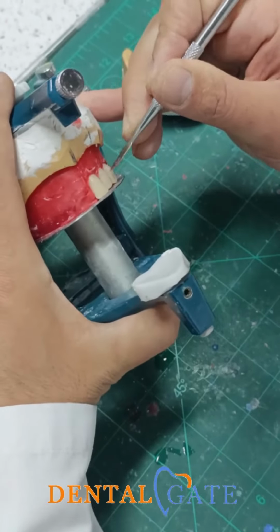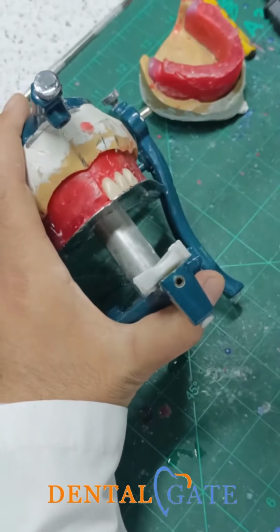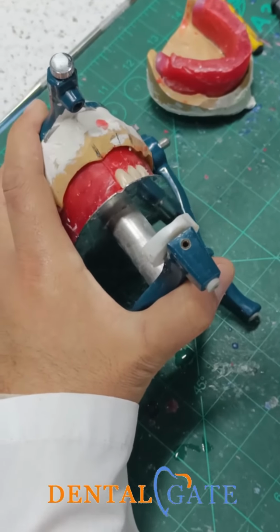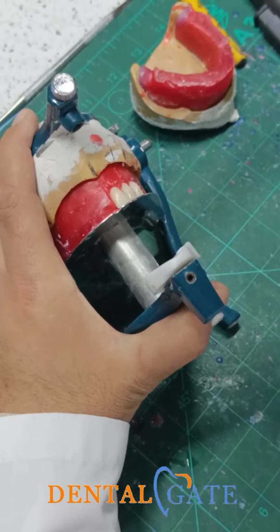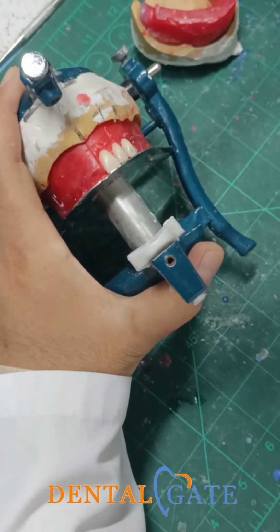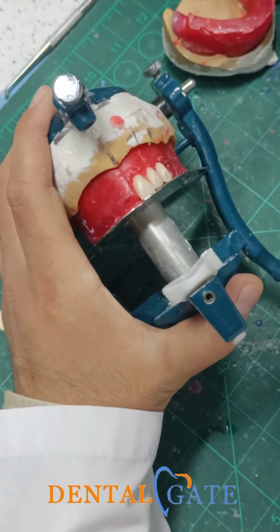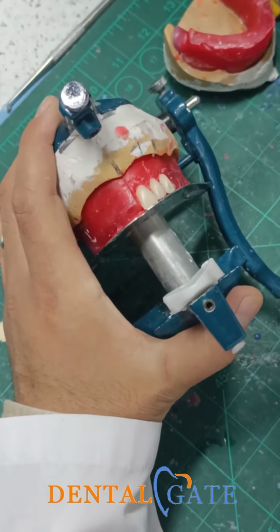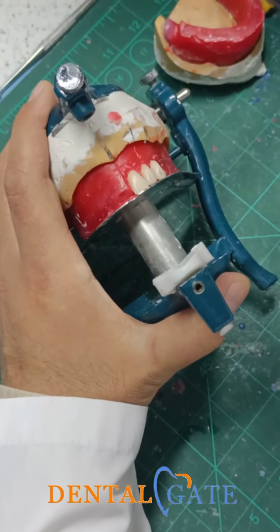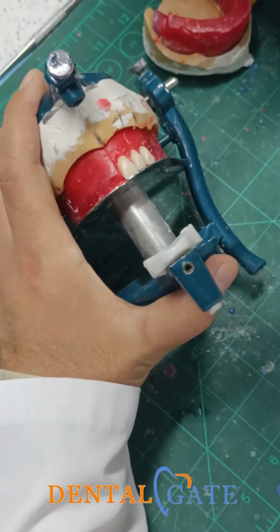For the canine, the long axis of the canine is a mandatory one. Please, this is a mandatory one. It should be parallel to the vertical axis. There is no inclination. Instead, the shape of the canine will show that we had an inclination within the shape, not within the tooth. You can see this within the lateral as well, because the anatomical landmark will be inclined distally.